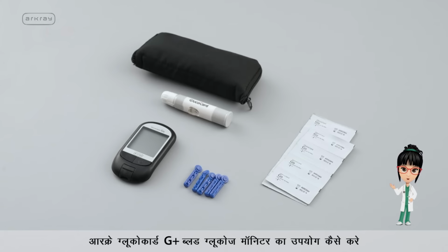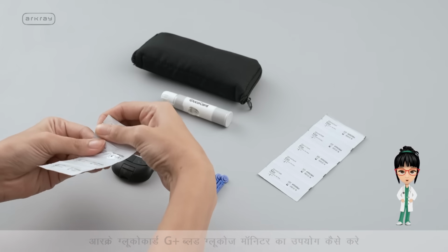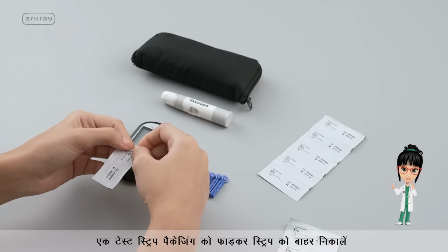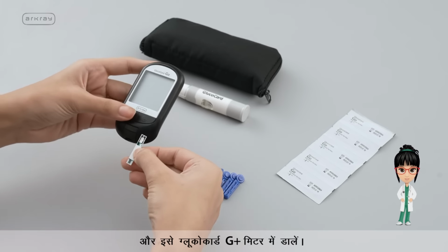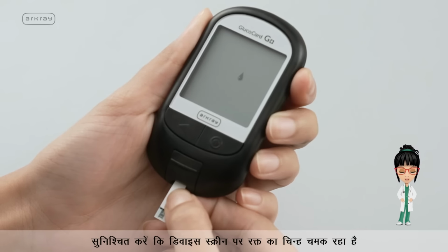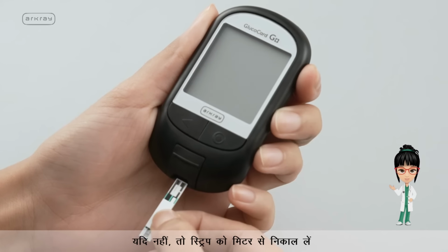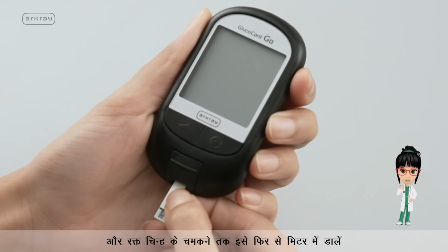Here's how to use the Arkray Glucocard G Plus blood glucose meter. Tear open one test strip packaging. Take out the strip and insert it into the Glucocard G Plus device. It turns on immediately upon inserting the strip. Ensure that the blood symbol is flashing on the device screen. If not, then take the strip out from the device and reinsert it till the blood symbol is flashing.